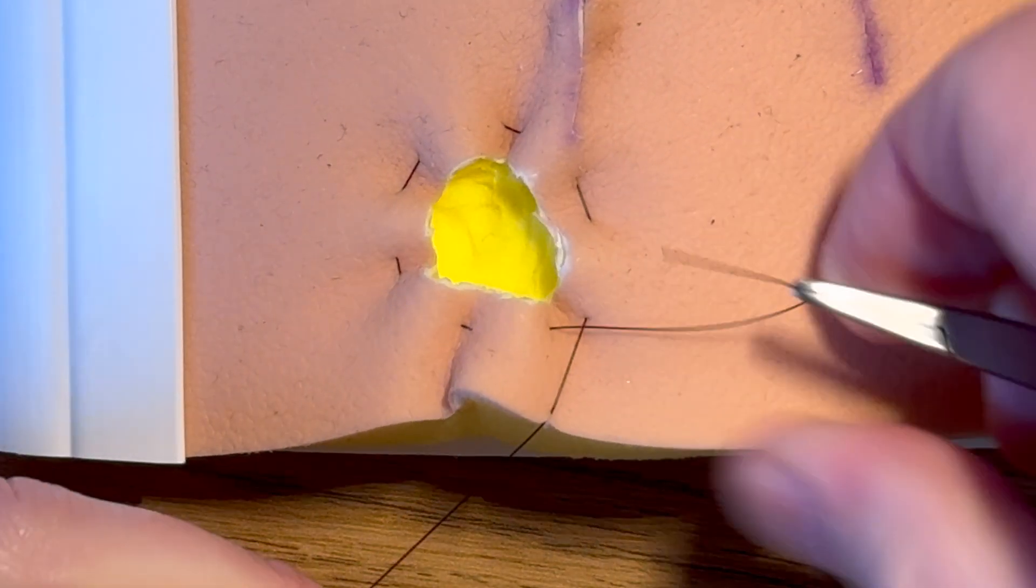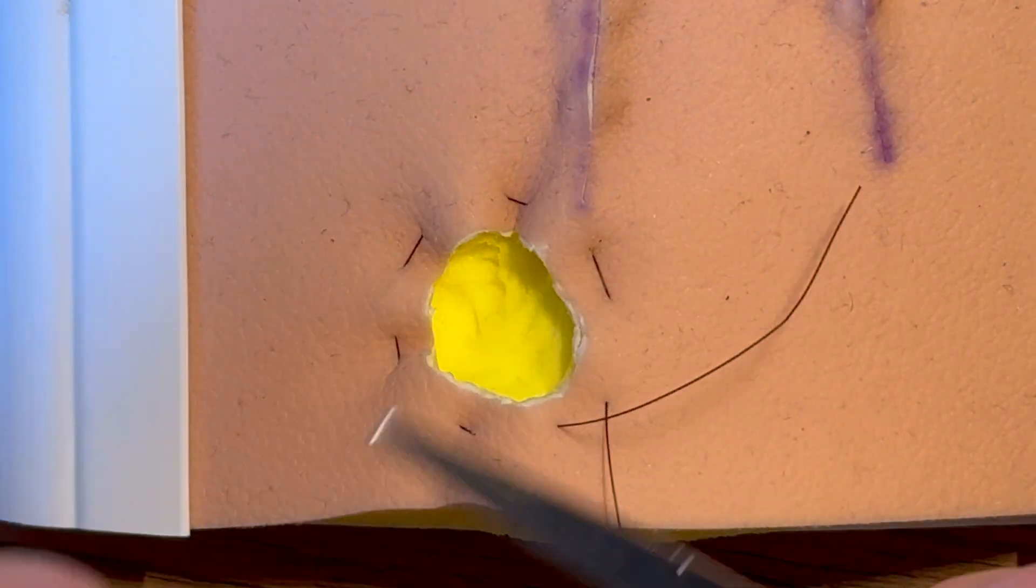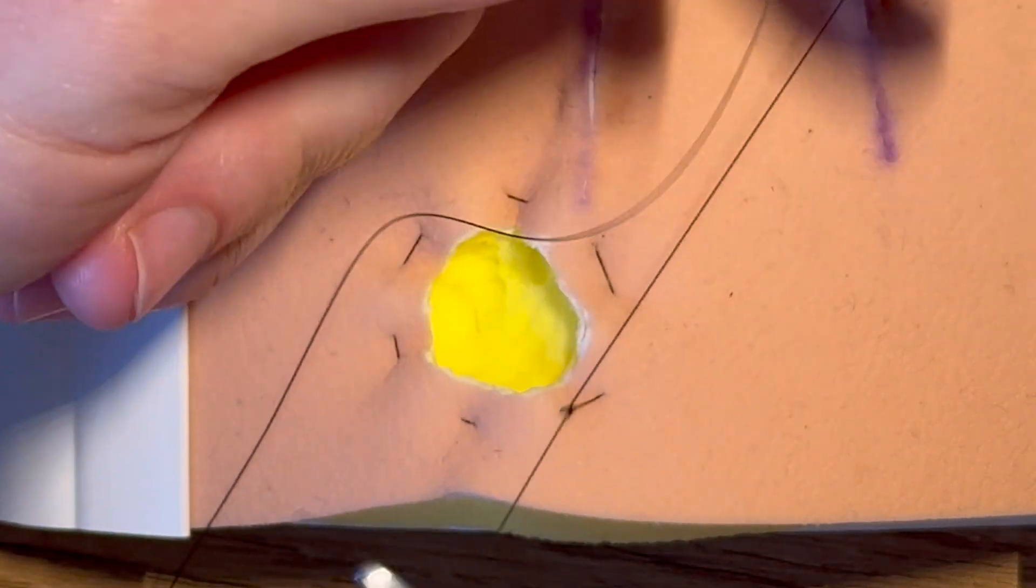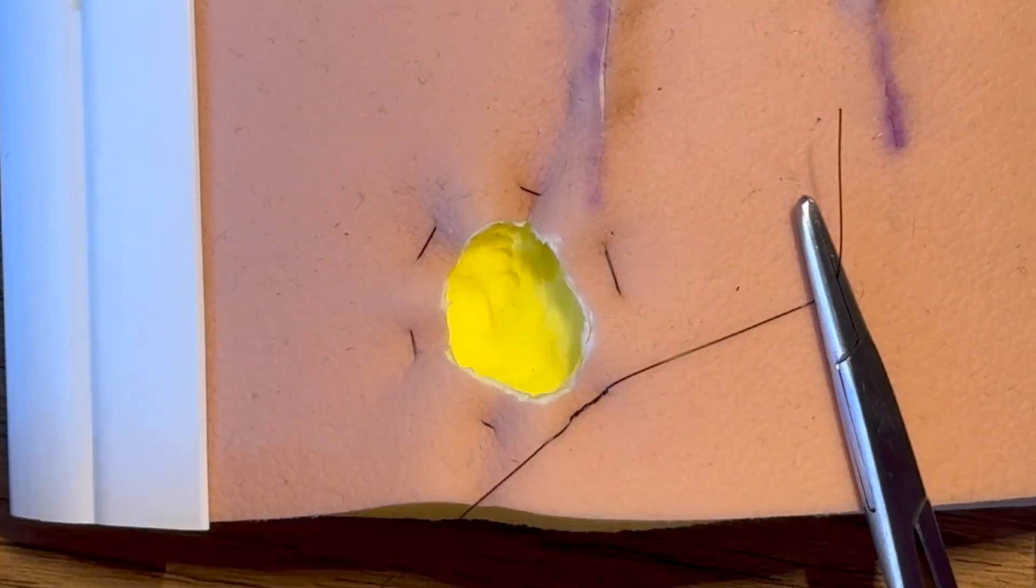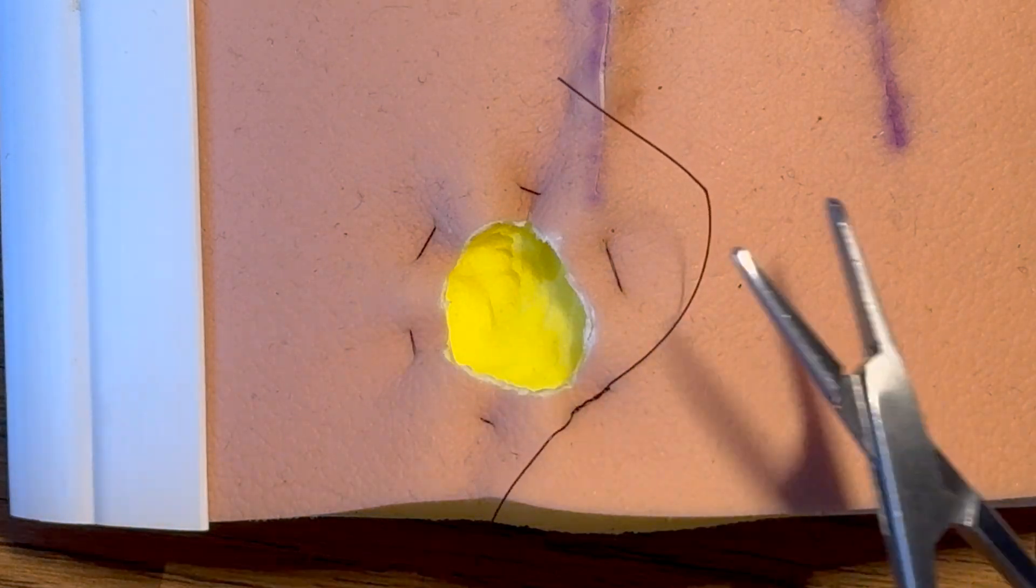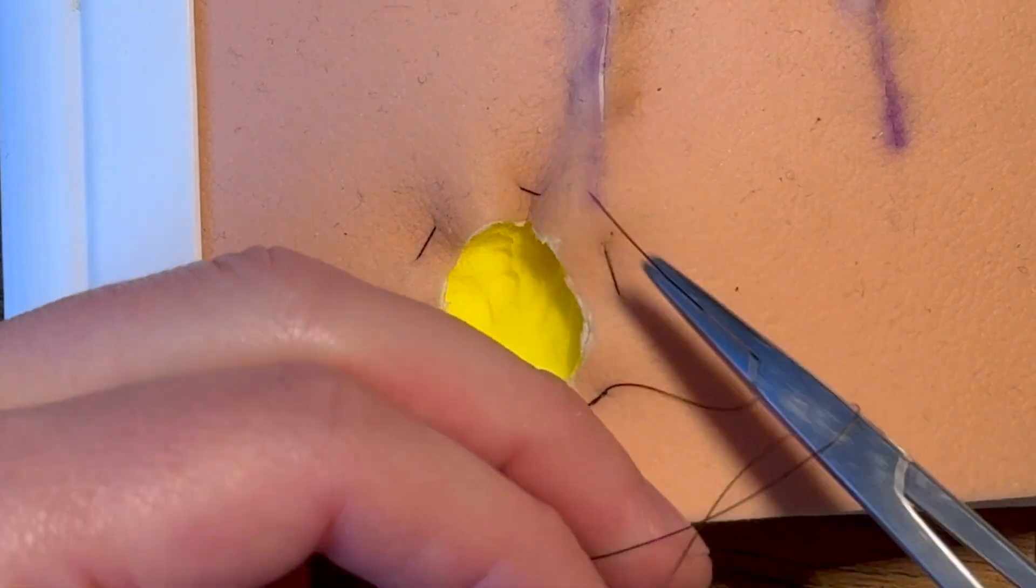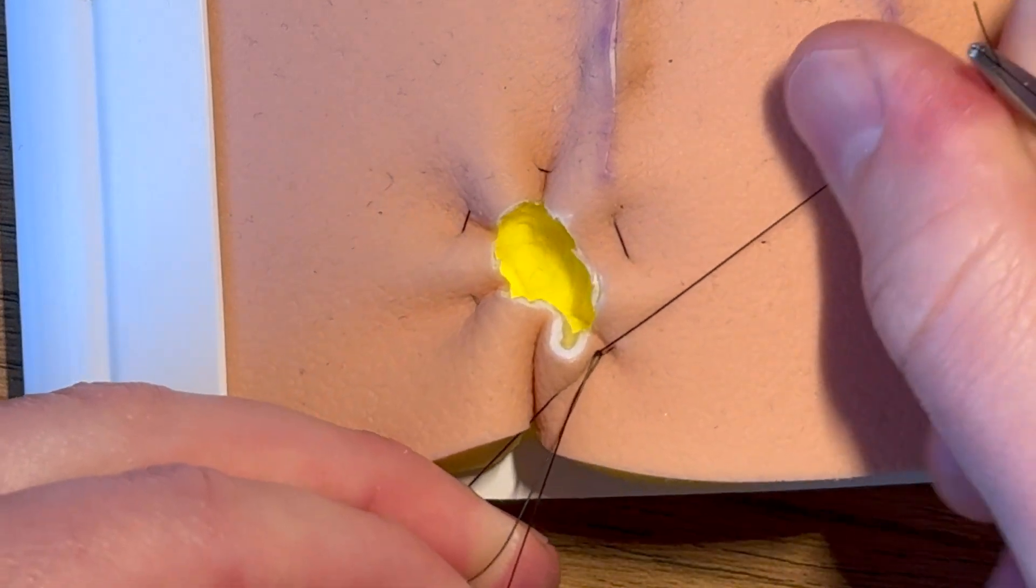So we're going to need to put a surgeon's knot, well we're going to put the first two throws of a surgeon's knot in like that just to hold the knot in place. And then because it's under tension it's going to slip, we're going to need to do something like this just to hold it in position.